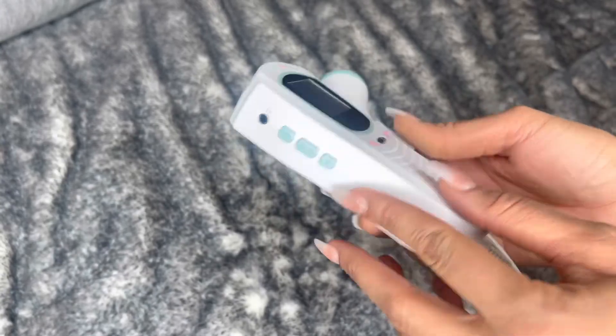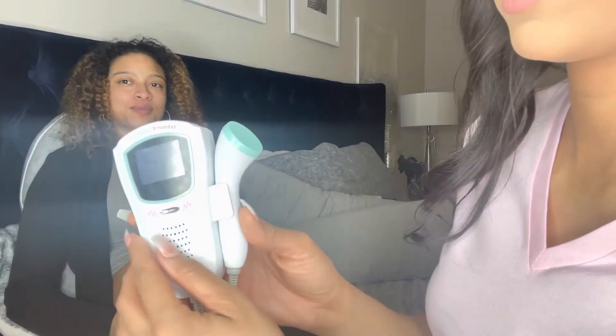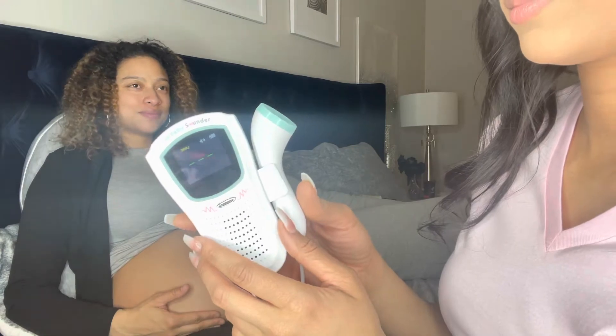This is the power button and volume control, and it even has a socket for audio output that can be connected to earphones or voice recorders.